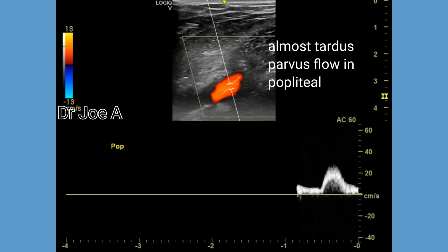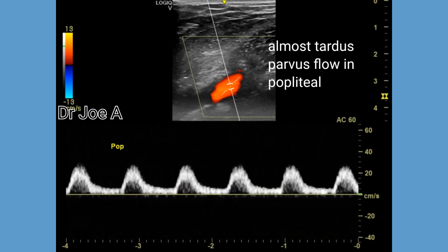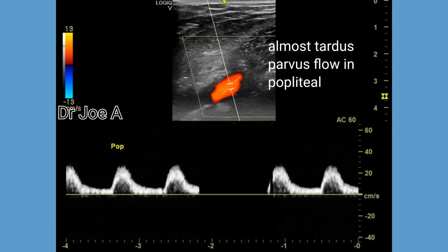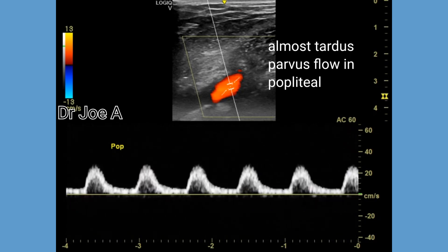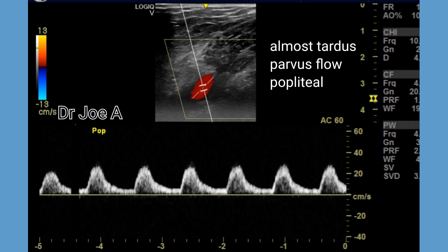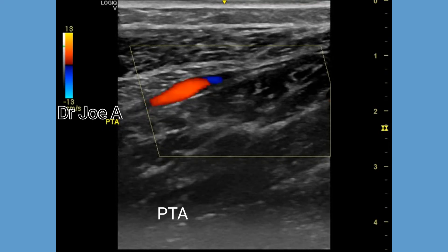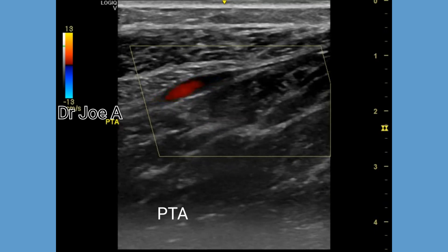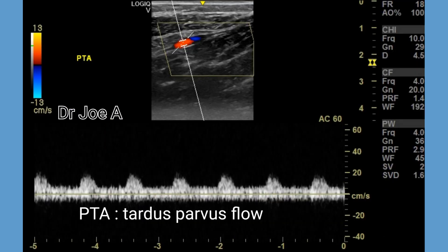We cannot expect much flow below the knee level in this patient due to the severe reduction in flow in the popliteal tree. The posterior tibial artery also shows tardus-parvus flow.